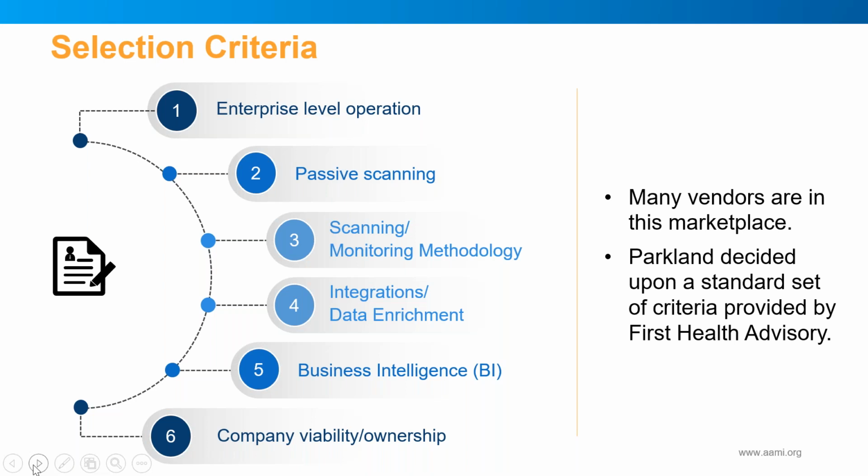And so the information coming out of whatever selection we were going to make was going to supplement and enhance data integrity of our database. So that goes on to bullet 4. Having a tool for your scanning and cybersecurity management to integrate into your medical device database, your CMMS, is important because this could really help supplement and better tighten up your data integrity of your inventory.